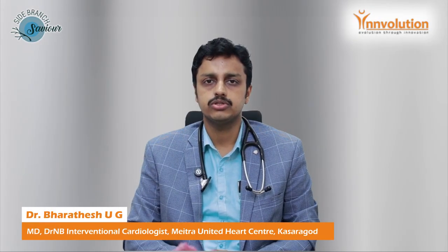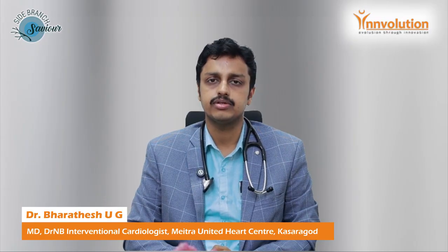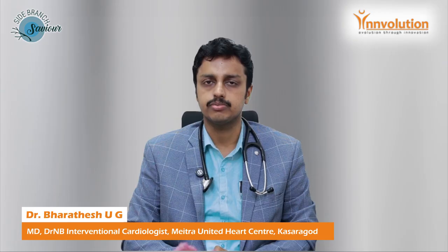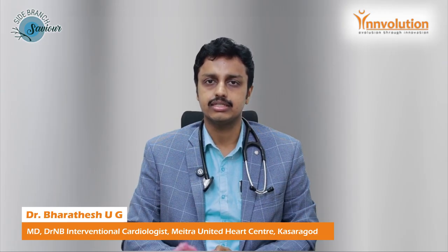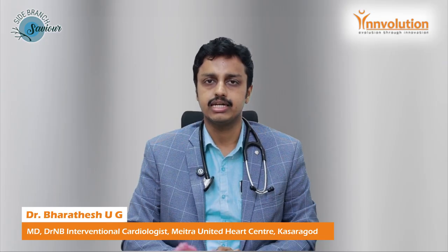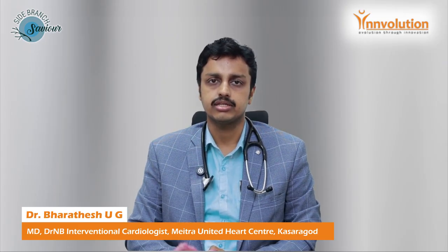Out of these cases, I usually see 10 to 20% are very complex, which has calcium, which is tortuous, and ostial lesions, which involves the left main, LAD and LCX. So for this, we require a very good cath lab team with the supportive staff. Along with that, the hardware should be very good, which has an international recognition with the open cell design, as I told earlier. Very good expansion capacity, which is seen especially in an open cell design technology, so as to protect the side branch.